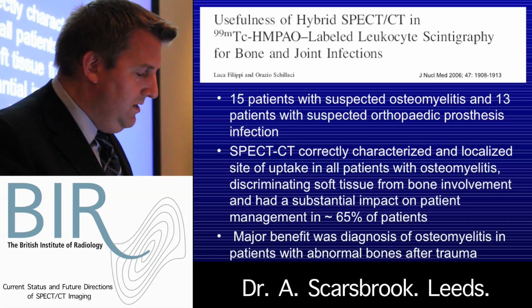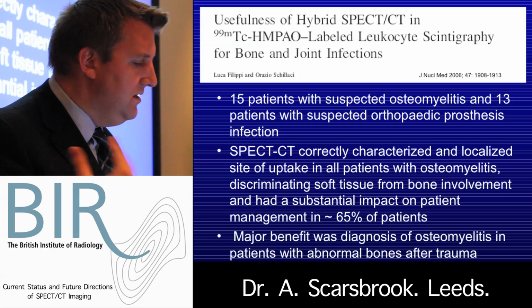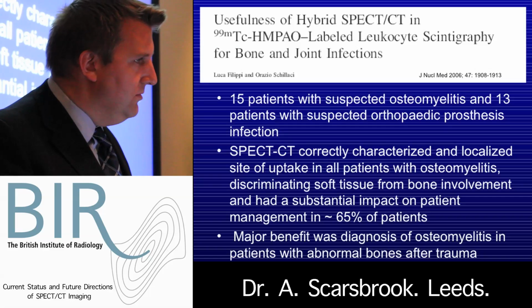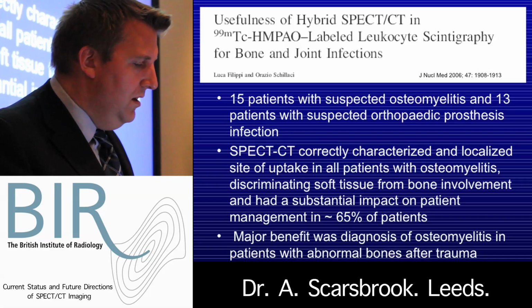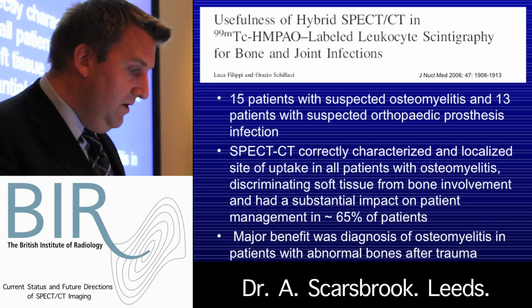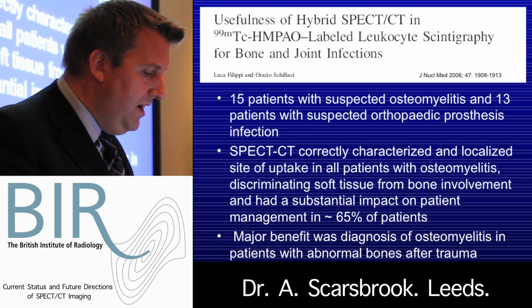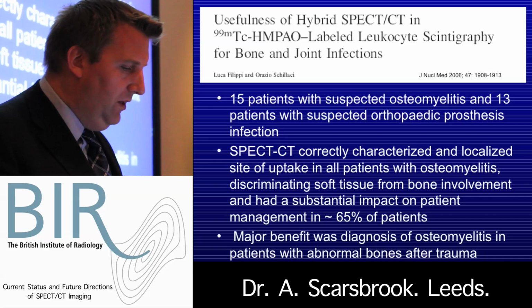And you won't be surprised to hear that SPECT-CT correctly characterised and localised uptake in all of the patients with osteomyelitis and was able to very clearly discriminate between soft tissue and bone infection. And as a consequence, it had an impact on a major percentage of patients, as we've heard frequently today. And the particular benefit was in patients with osteomyelitis, where they had abnormal bones following trauma.